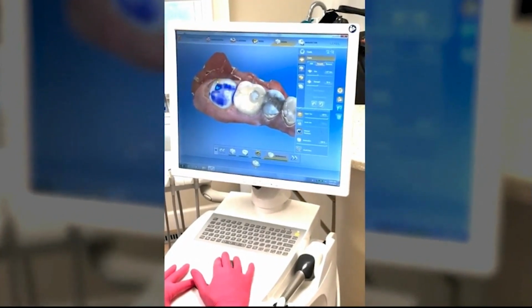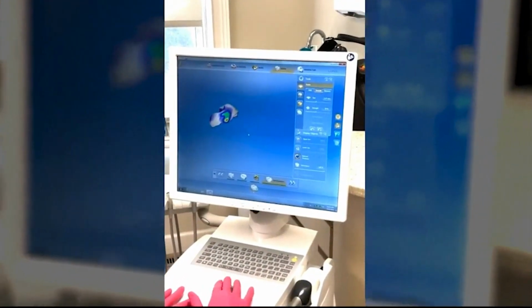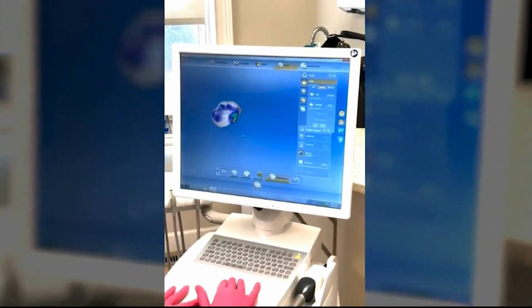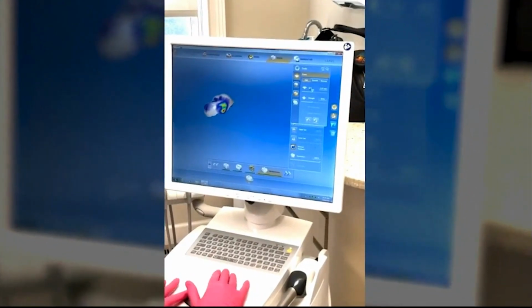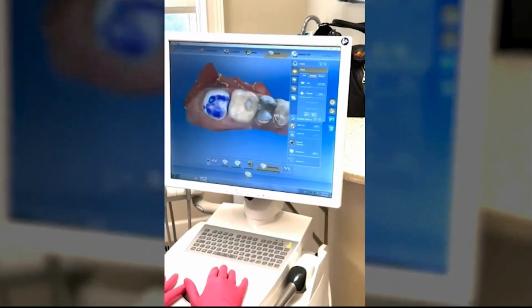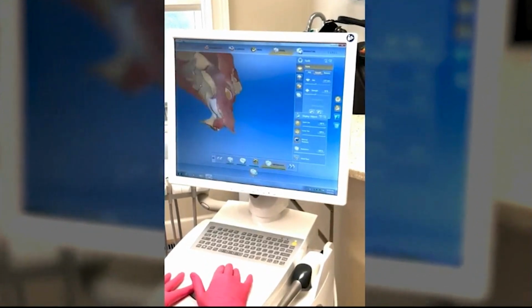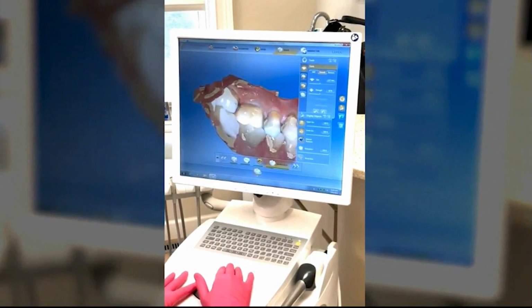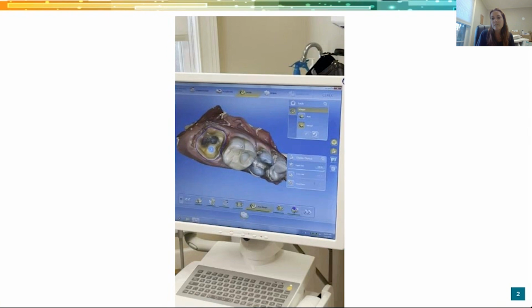One thing Sarah is really good at is getting a lot of anatomy in your tooth. I tend to go over and smooth that anatomy out a little bit. Your patients are going from most likely a broken down old restoration that's probably really flat and worn down, and that's kind of what they're used to. So if you put a lot of anatomy back into the tooth, sometimes they say it feels rough or weird. So I don't remove the anatomy, but I do smooth it out a little bit. So there, I was just checking the bite, making sure it fits well with the opposing teeth, and checking my contacts.